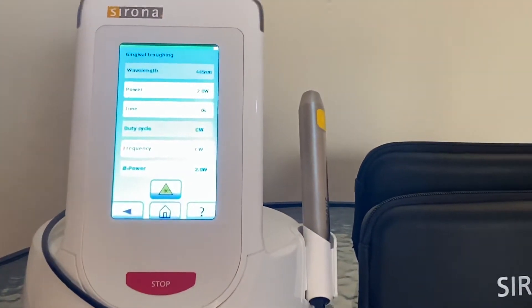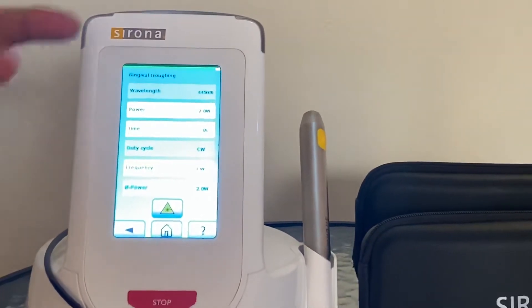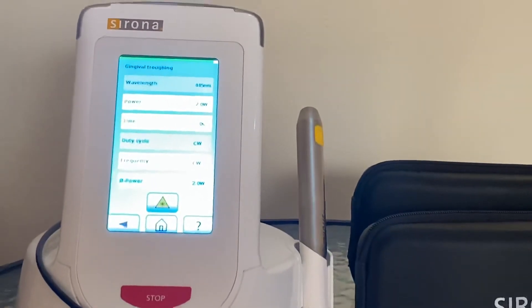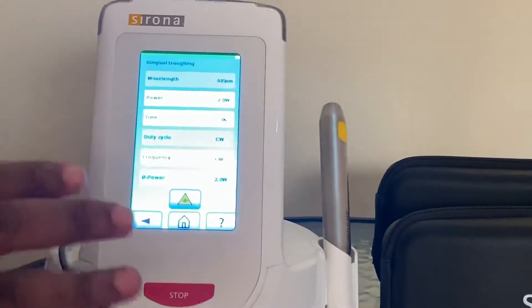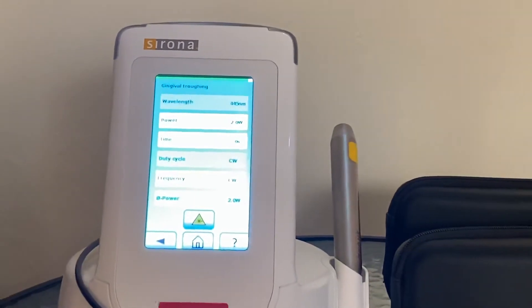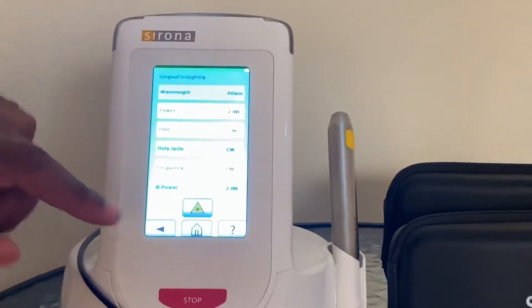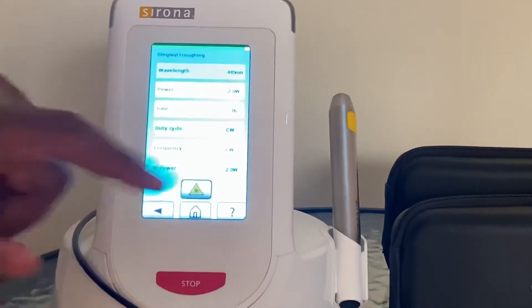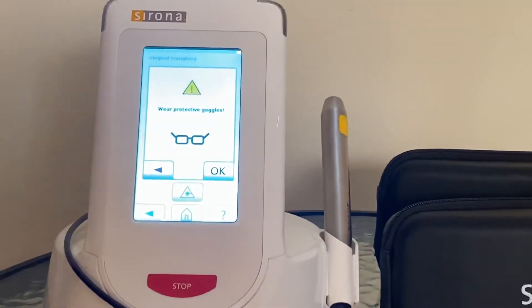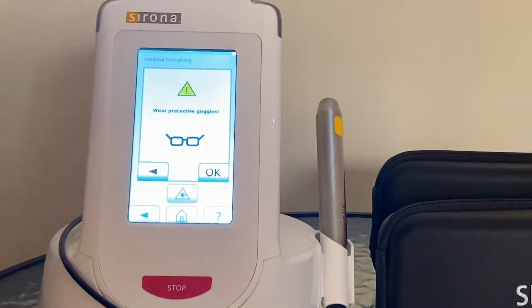It is rare that you need to adjust, but if you go for further training, there are times when you may need to adjust to achieve something specific. In this case, let's assume we want to use this laser machine for gingival troughing with a preset program. Once I am happy with that, I'll press that button. Notice what it tells me: wear protective goggles. Laser light is a danger to your eyes, to your patient, and to your assistant.